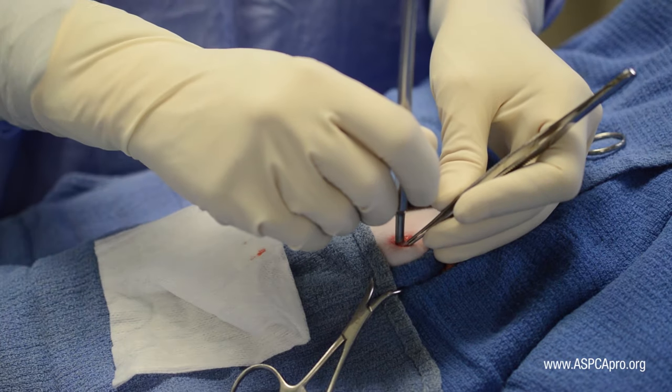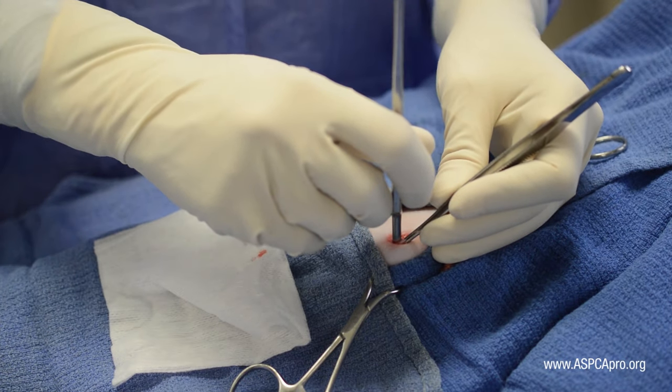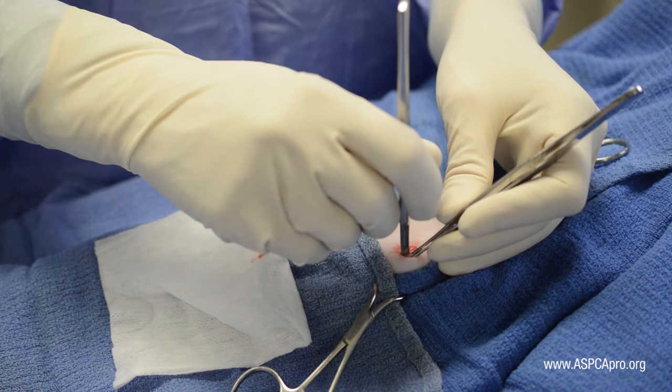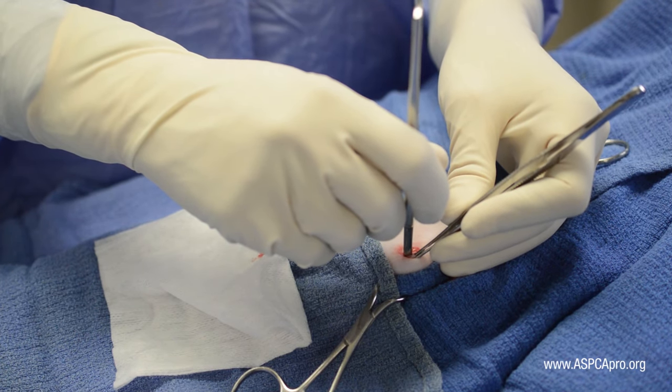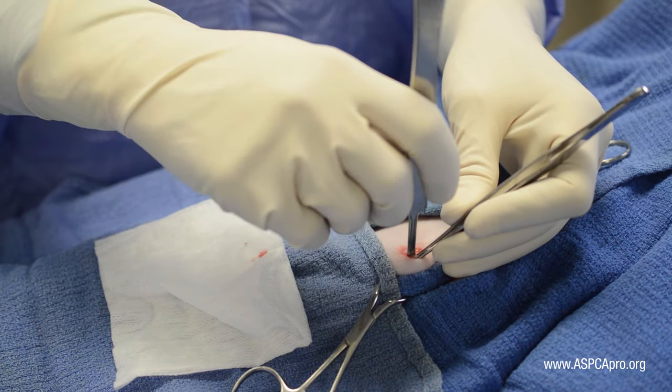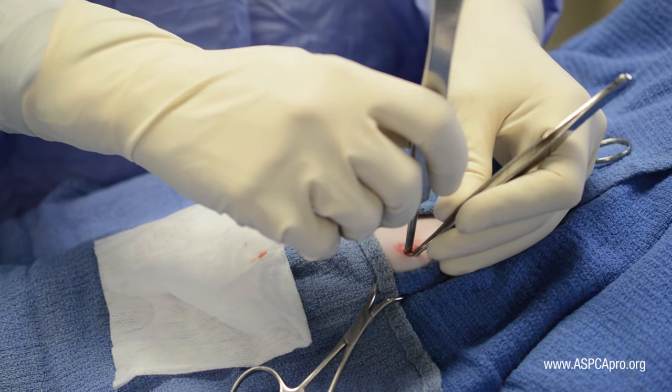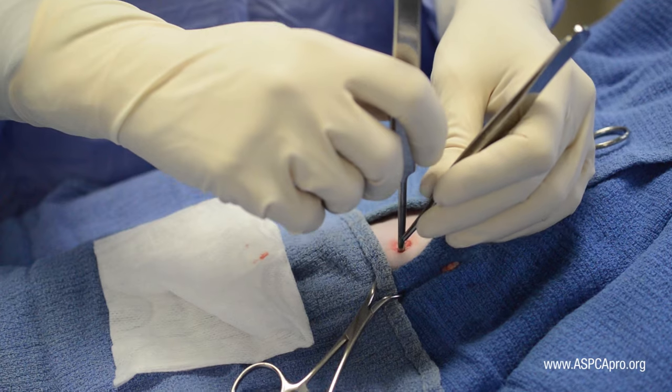When the hook reaches the dorsum of the patient, apply lateral traction to the body wall in order to orient the spay hook as perpendicularly as possible to the patient's dorsum. Then, rotate the handle medially toward the patient's midline and begin a very gentle slide or bounce towards midline.